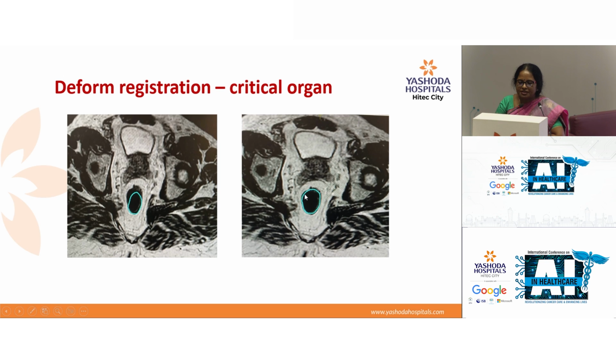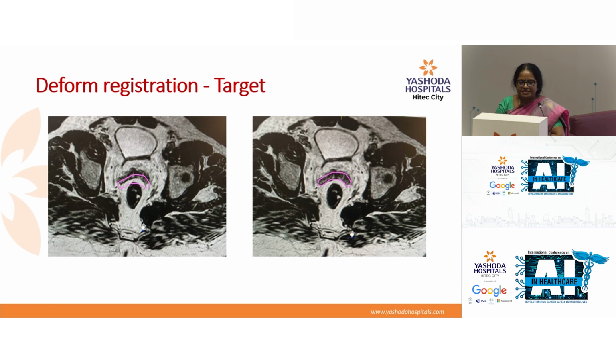Only a little bit here and there, a millimeter or less than a millimeter part of the rectum might be missing, which can be easily corrected. But with the deep learning technology which is yet to come, that will also solve even these minimal problems. So maybe the time will come even faster.